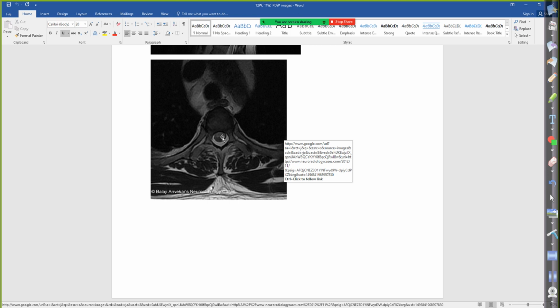The spinal cord, in this situation, is pushed up to the top because we're laying on our back here. And for some reason, the fluid has accumulated at the base here. But you have CSF fluid that normally surrounds the spinal cord completely, and the spinal cord can move around in that spinal canal. So, CSF here.